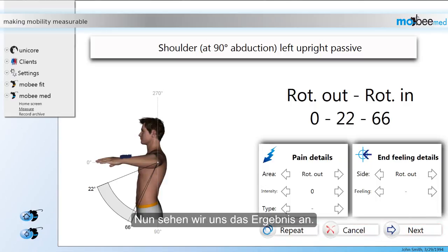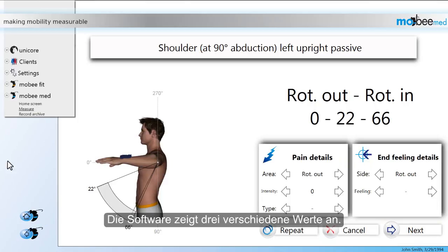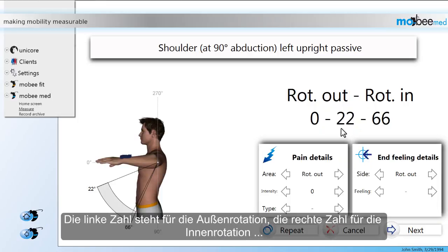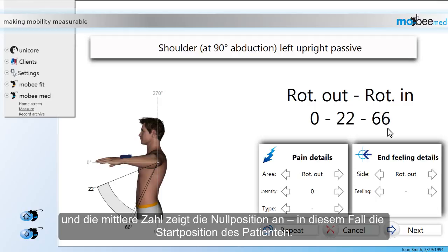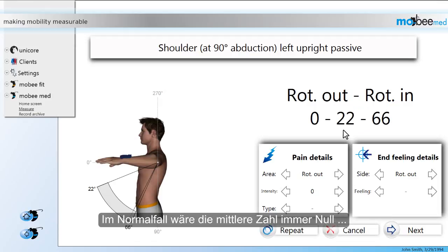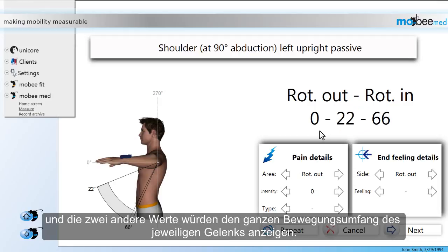Now let's take a look at the results. As you can see, the software shows three different values. The number on the left stands for the outward rotation. The number on the right indicates the inward rotation. The number in the middle stands for the zero position — and in this case, the starting position of the patient. Under normal circumstances, the number in the middle would always be zero and the two other values would indicate the full range of motion of the individual joint.